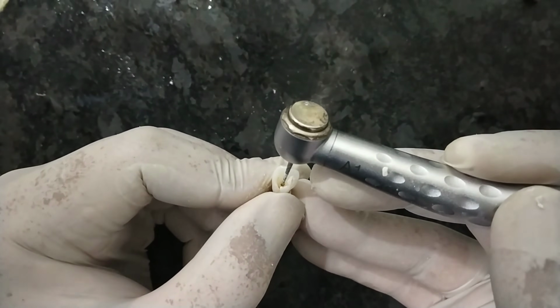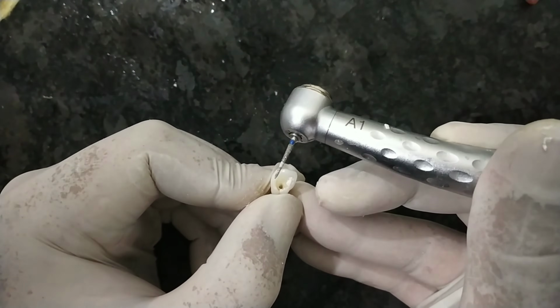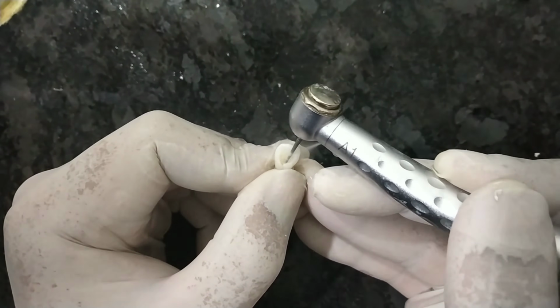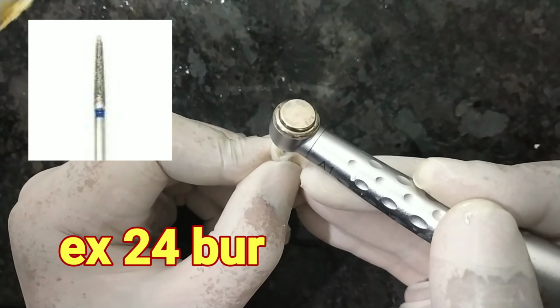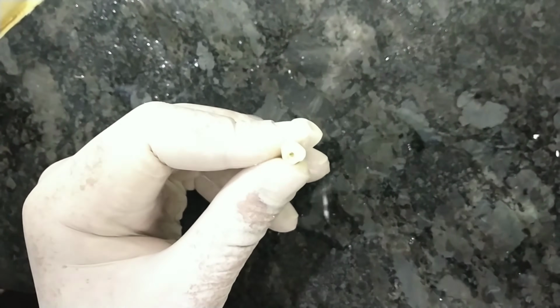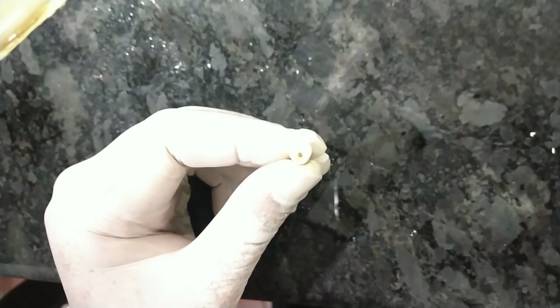We have to remove the extra dentin from the floor and from the side and from the axial walls. So this is the EX24 burr in which the tip is non-cutting, and we have to just run it a little bit smoothly. You have to extend the walls in all directions. So why are we doing this? We are doing this so that our files go straight up till the apex.